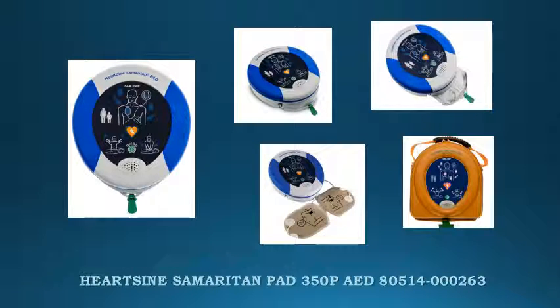The HeartSign Samaritan Pad 350P Semi-Automatic AED was designed specially for use in public areas, providing a sophisticated defibrillator for adult or pediatric use, inside a lightweight and easy-to-operate system.